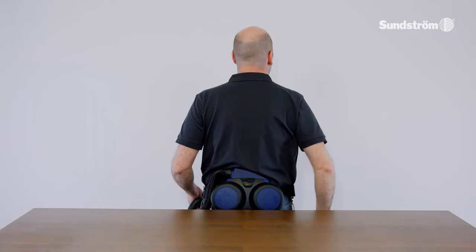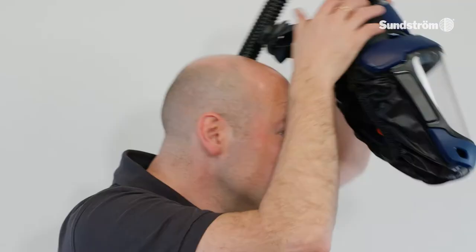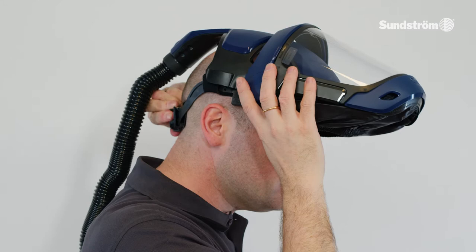Putting the face shield on. Start the fan unit. Adjust the width of the head harness using the knob located at the rear of the harness. Lower the visor.